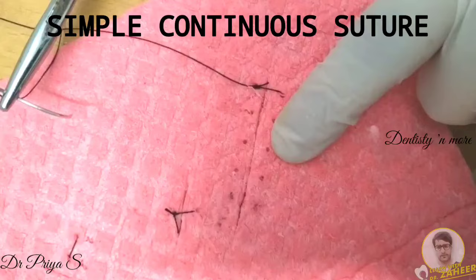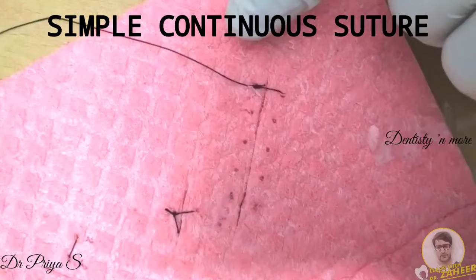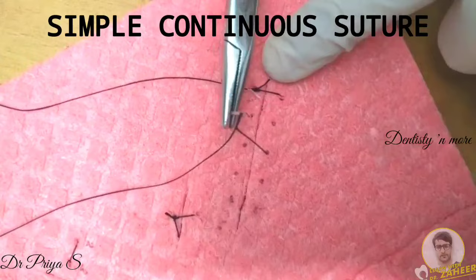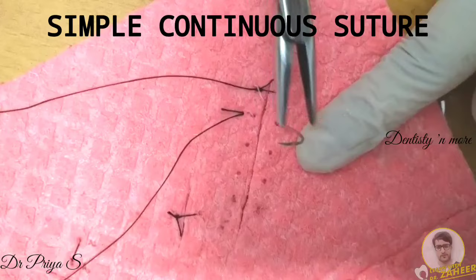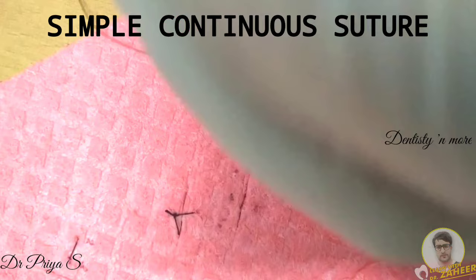This is similar to the one made in the first exercise. The only difference is that the excess suture material is kept at its full length — you don't cut away any excess suture material. After you have tied a surgeon's knot, continue taking bites on either side for the entire length of the incision.